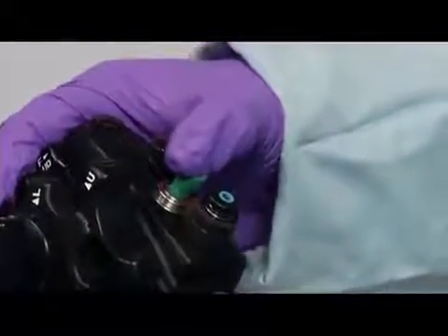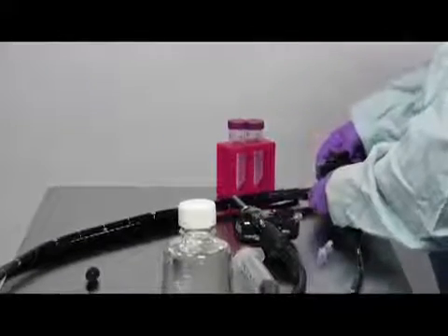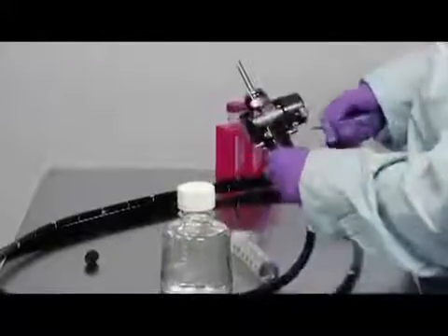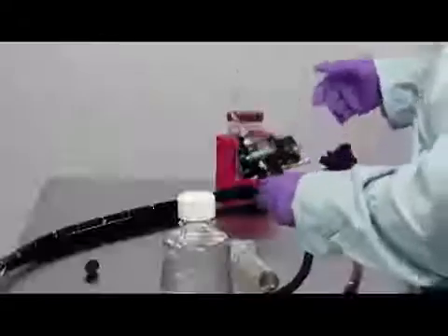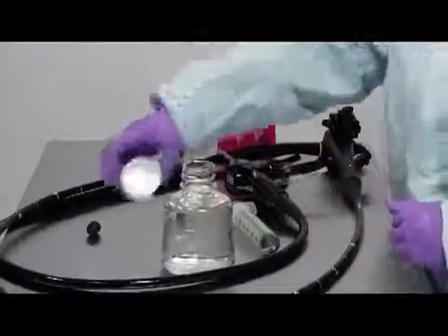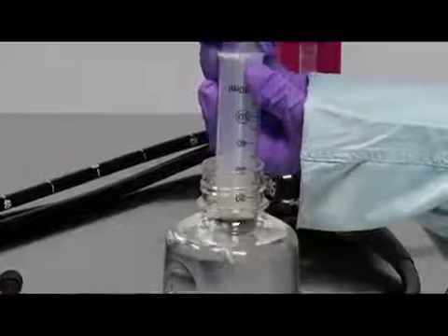If it's too firm, the water is going to be really hard to push through. So if you're getting a lot of resistance, go back and loosen it up a little bit, and then your water should run through more smoothly. The rest of the procedure goes pretty much just like the procedure we just saw. You put your connector on the light guide end, draw up 40 mils of water, and then once you've drawn that up, you'll just connect that back onto the connector.